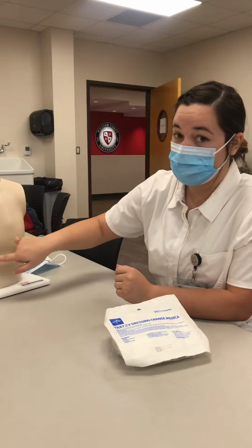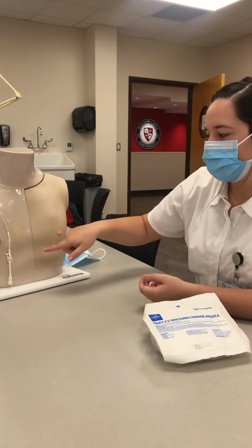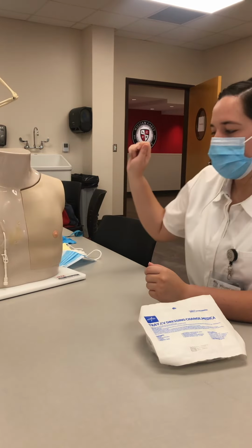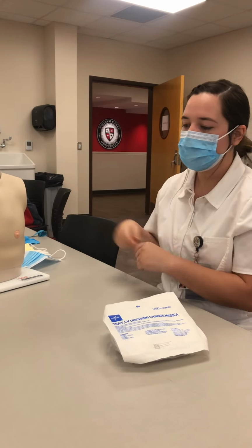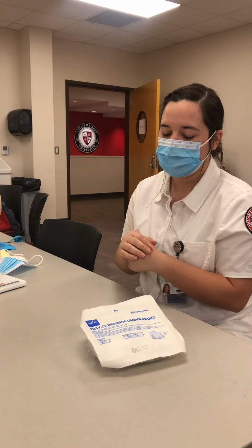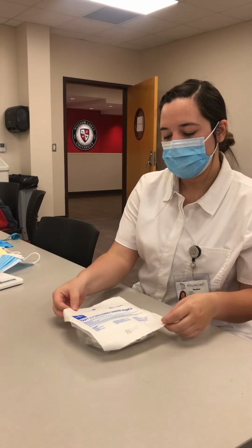So we're going to take off this tegaderm that's on. I know he does not have one on, but for demonstration purposes, he'd have one on. We're going to take it off, and we're going to dispose of that. We're going to take off our gloves, dispose of our gloves, and we're going to rewash our hands. And we're going to have our equipment ready to go.